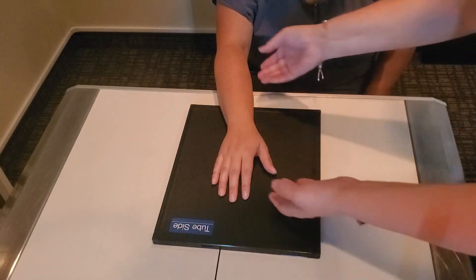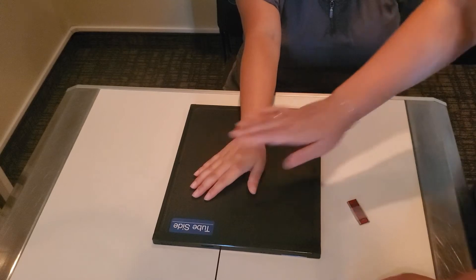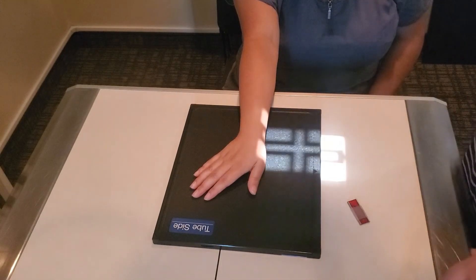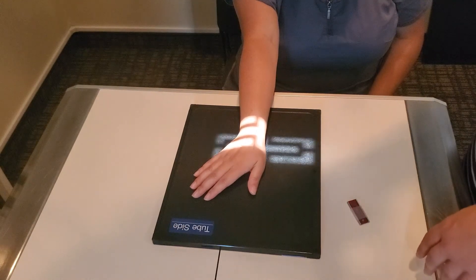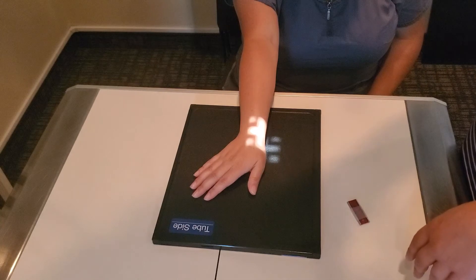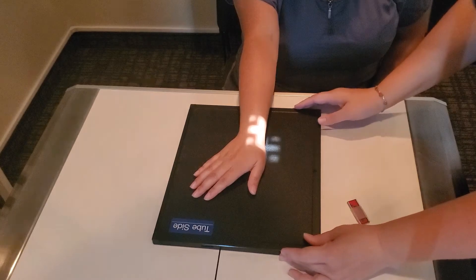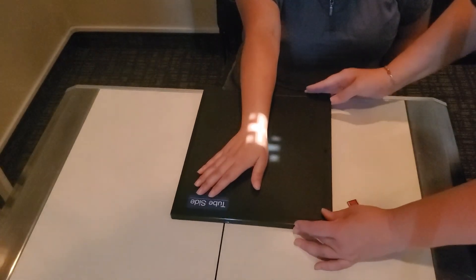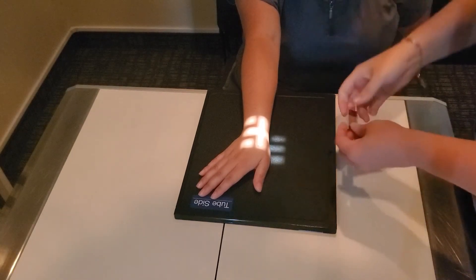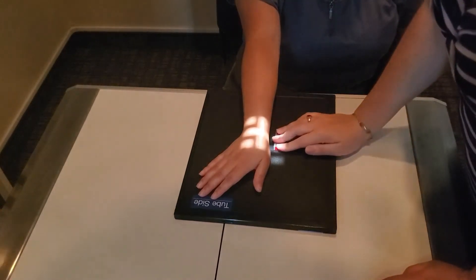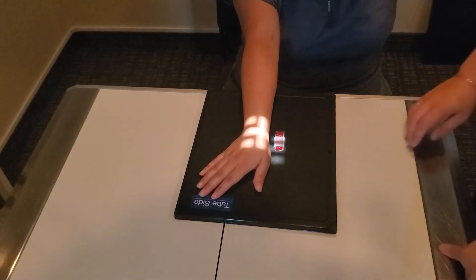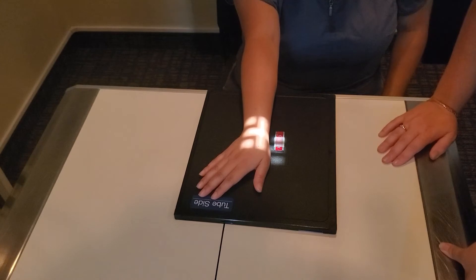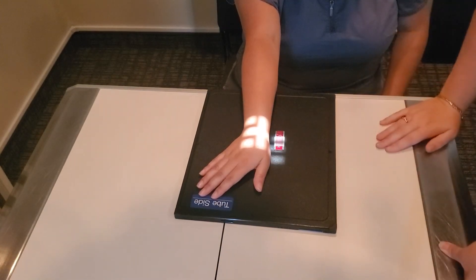So I'm going to have her hand in ulnar deviation. That ulnar deviation pulls those other carpals away from that scaphoid. And you collimate tight on this image because you're just looking at the scaphoid we don't care about the other carpals at all. Lift up for me real quick again I want to get my part as centered on the cassette as possible. I don't expect you guys to collimate this small. You're still learning so don't try to be a hero just get it started where you're at. And that would be your ulnar deviation scaphoid image, okay?